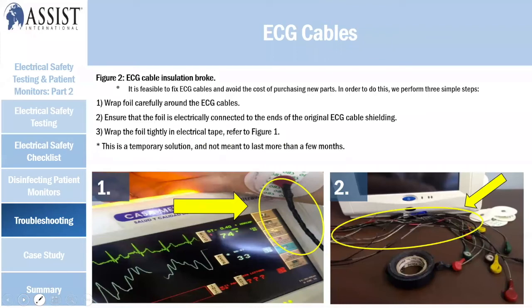We did wrap it with the black tape, and this is a temporary solution. It can maybe last a few months until you get a replacement ECG cable. So you can see we did wrap the black tape on the ECG cable.